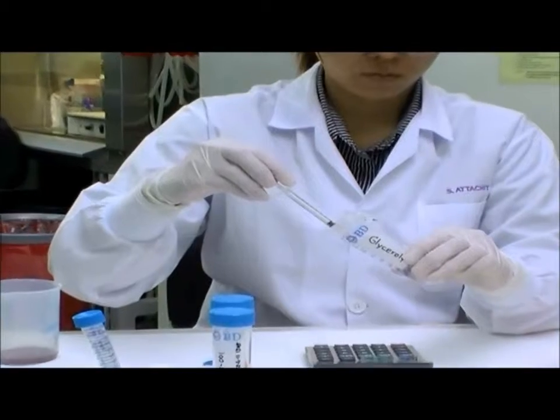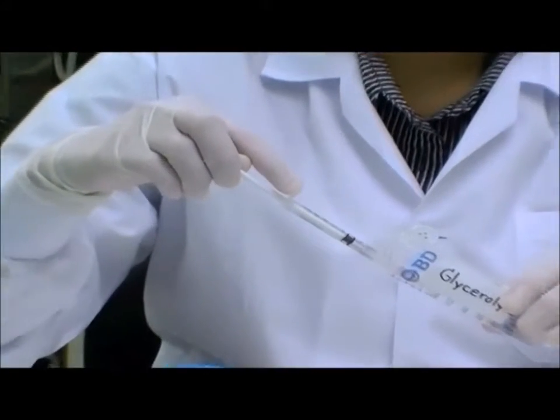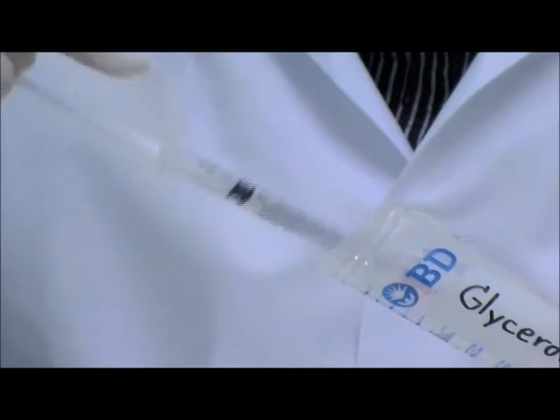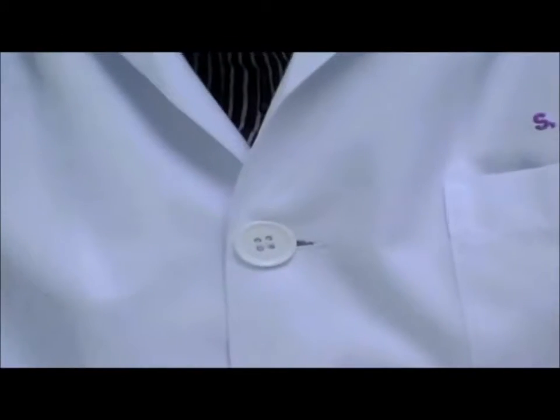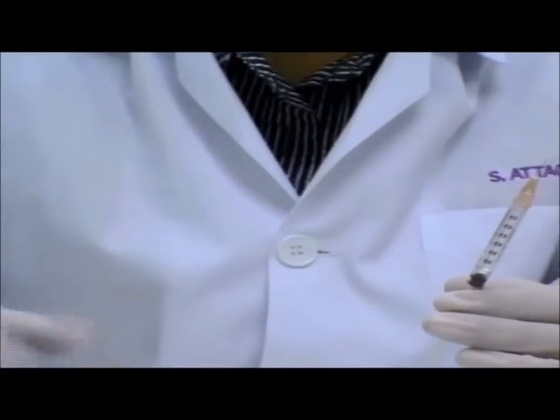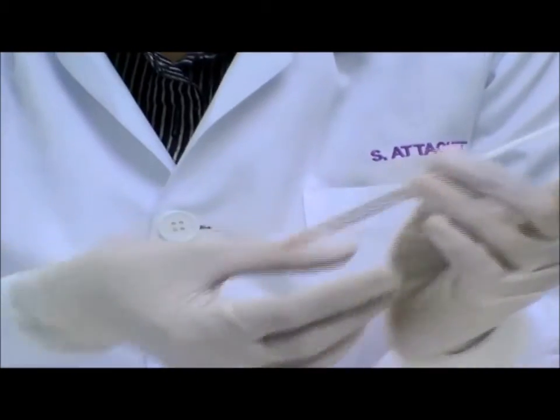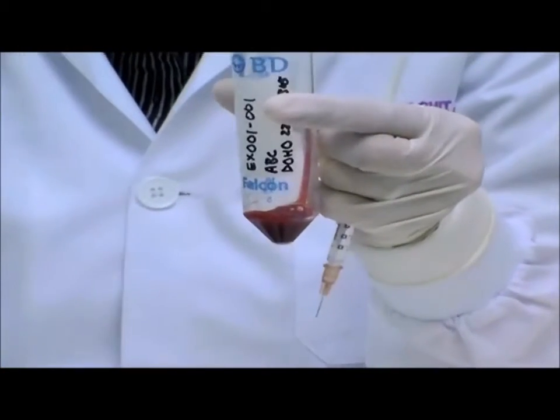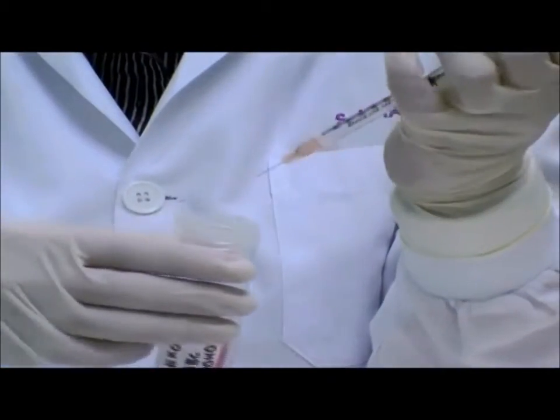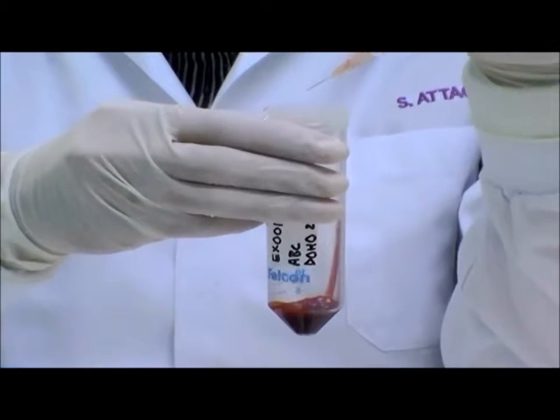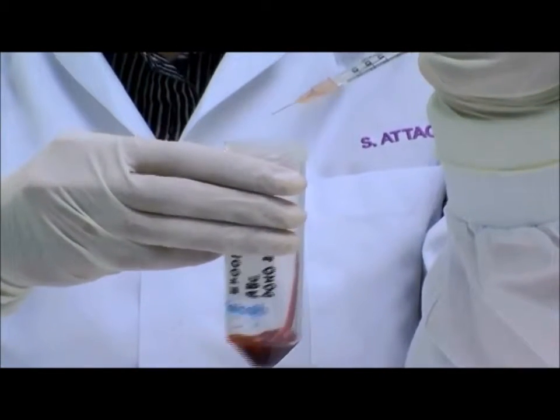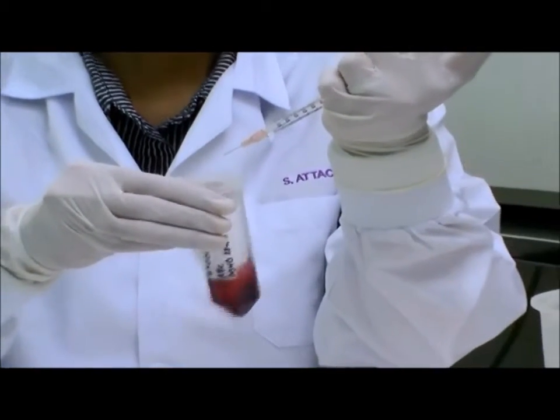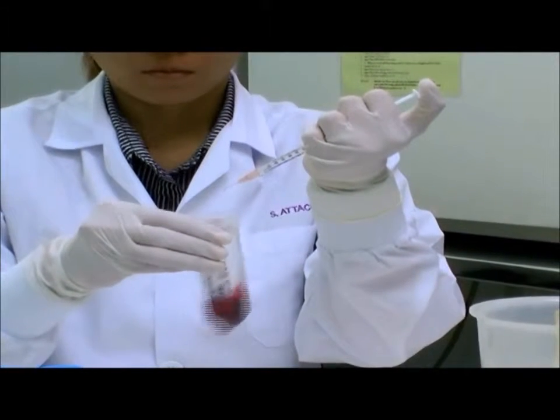Use the 1 ml syringe to measure out the volume of the glycerolite. Add the glycerolite drop-by-drop to the packed red cells with continuous shaking. This part of the procedure must be performed very slowly and should take no less than 3-5 minutes.